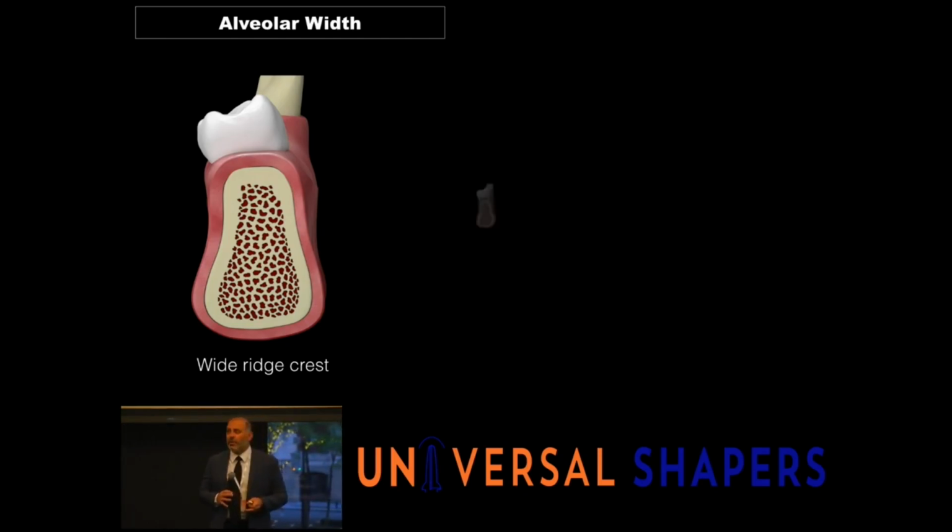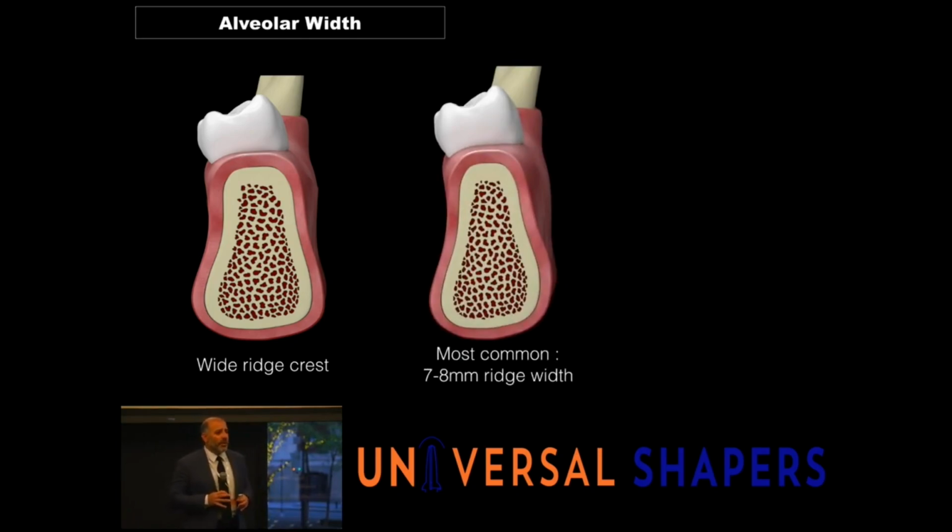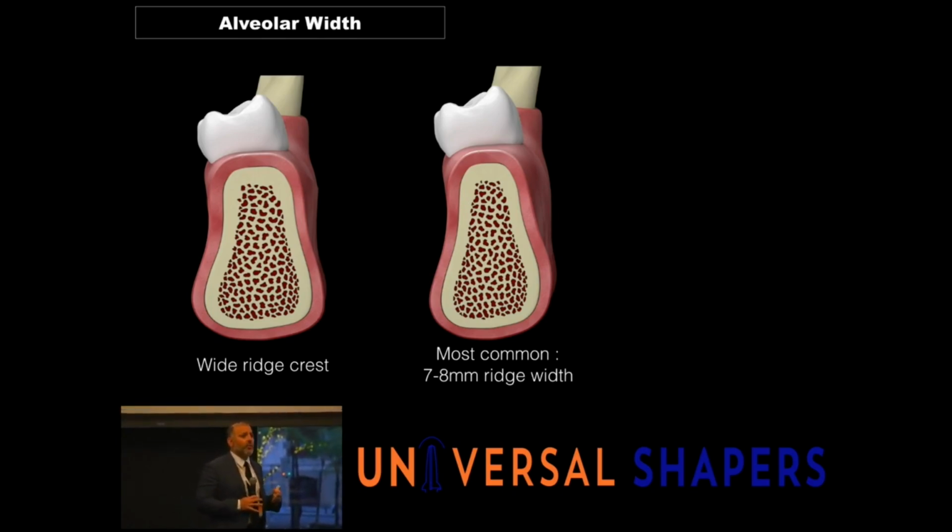And then we have scenarios where the bone's just a little bit thinner. And this is the most common scenario that presents to our office. We get a thin ridge that's not too thin. It's enough to place an implant, but it may not be the implant size that we're trying to fit in there. We may have to compromise and choose a more narrow implant.